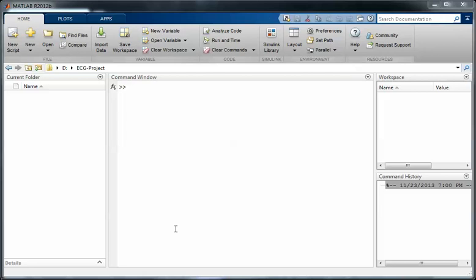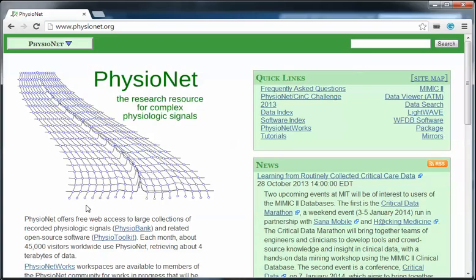Welcome everyone. In this tutorial I want to show you where you can find a collection of ECG signals and how you can load it in MATLAB application for analysis. Here is PhysioNet.org - this website provides a collection of physiological signals which is free for research.